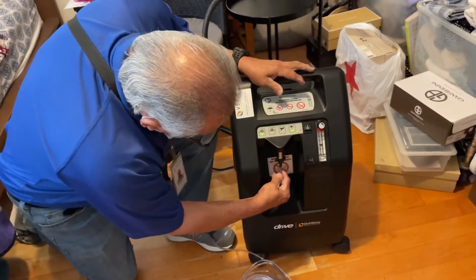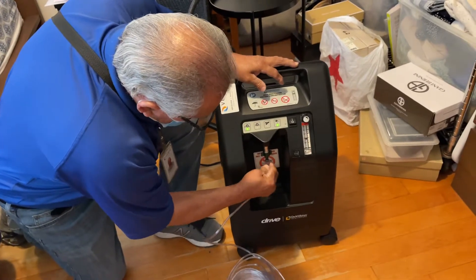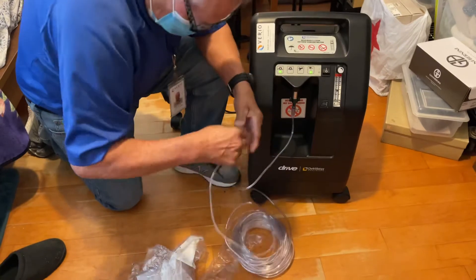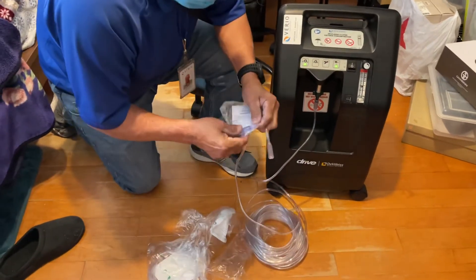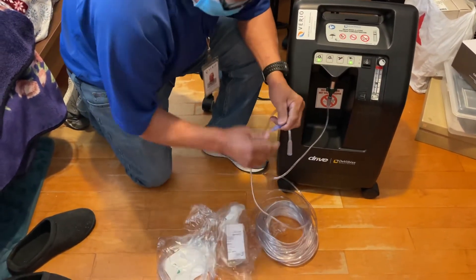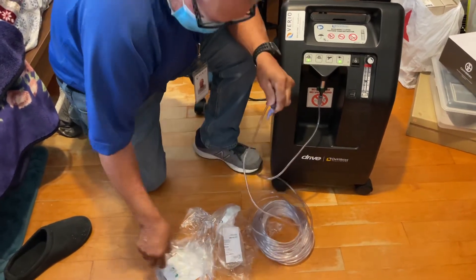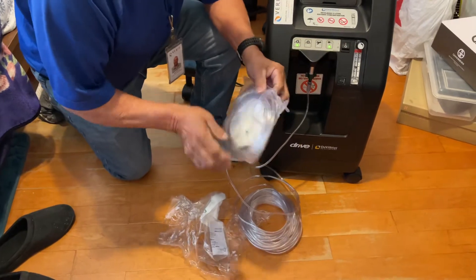This will go underneath here — this is the 50-foot tubing, just snug it. That's a little connector. You have everything in that tubing pack for a three-month supply. Disregard the humidifier bottle because she's not using that yet.